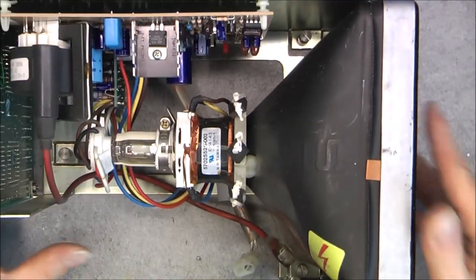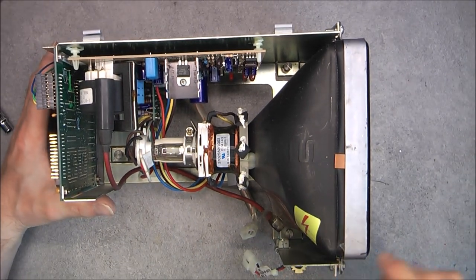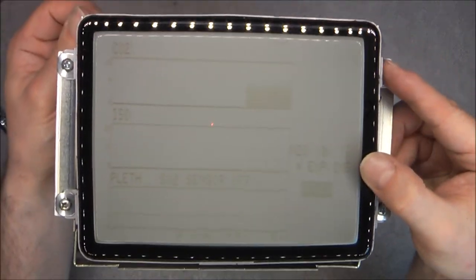So this is good. Quickly, the CRT assembly. Same here, I will not deal with it right now because I did just power off the device. So we might still have some high voltage stored in this CRT, and you can see the very bad burn mark on it.